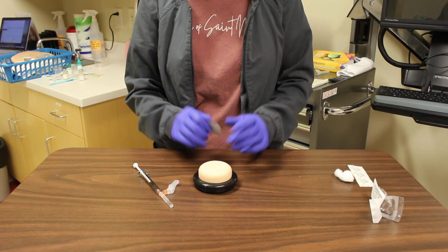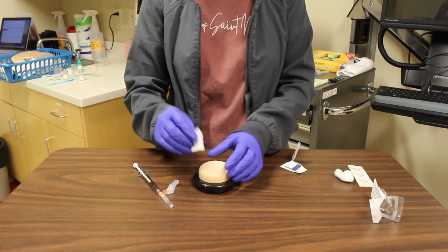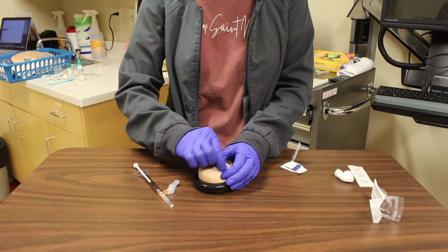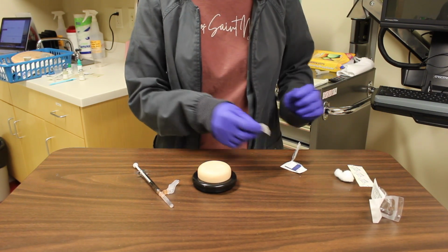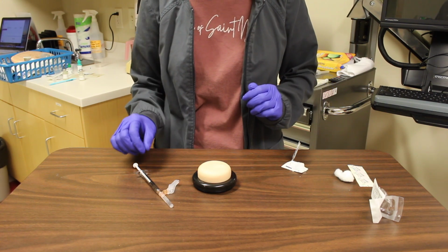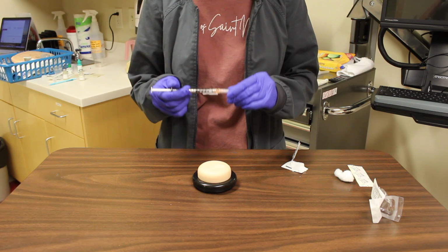Don clean procedural gloves. Clean the injection site with an antiseptic pad by circling from the center of the site outward for alcohol and using a back and forth motion for CHG products. Allow the site to completely dry. Remove the cap of the needle safely.